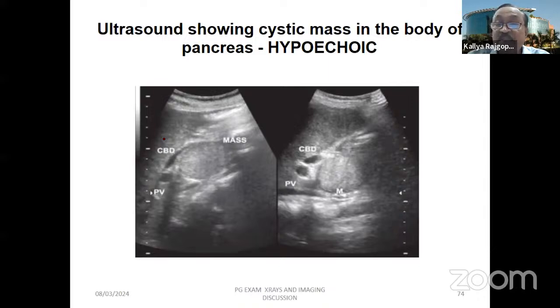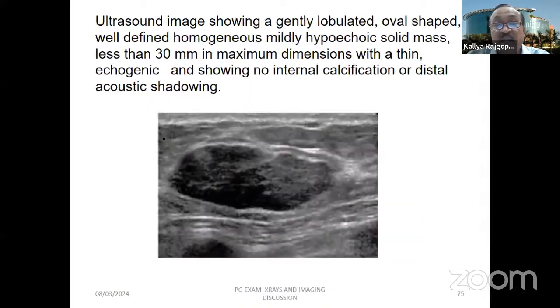So that probably is the limitation of ultrasound. And also we know that ultrasound is operator dependent. I'm not telling it's a problem, but if you look at the uses of ultrasound, it has become very, very handy now. And as I already repeated, it's an extension of the clinical examination.